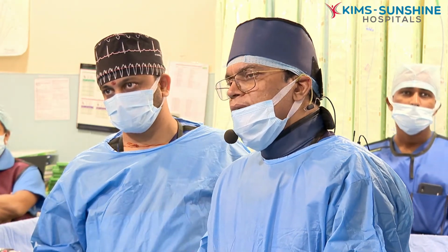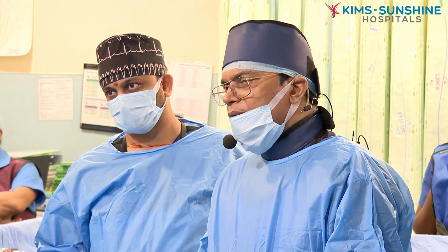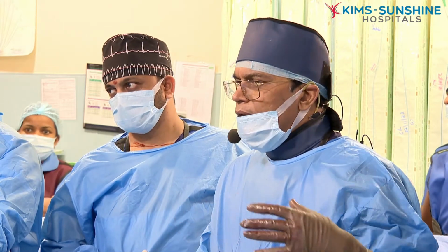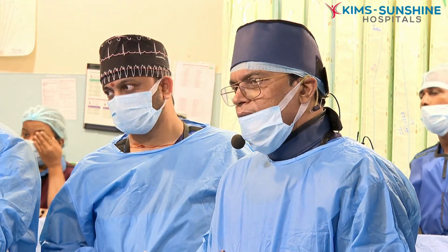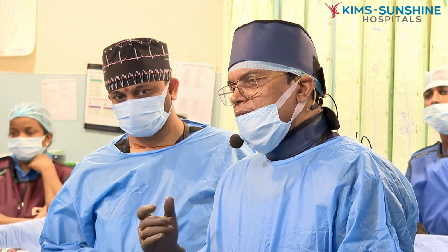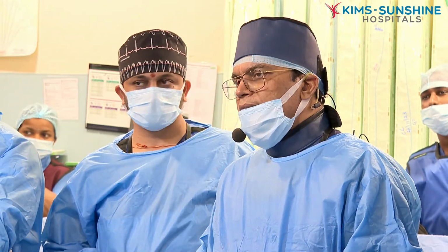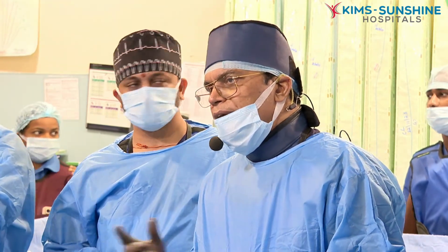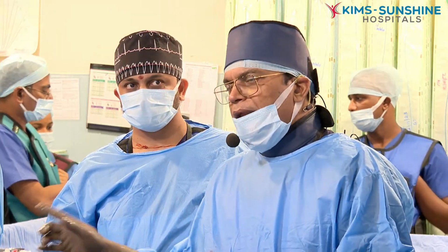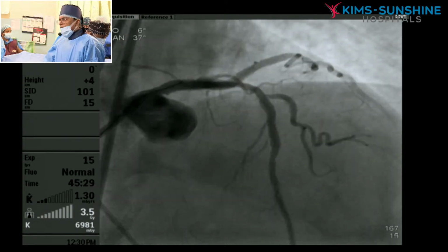But even today ROTA is a wonderful tool, but now the ROTA Pro is definitely much more handy, much simpler to use compared to the earlier system, where you need a lot of hand and foot coordination. That is not required with ROTA Pro. So it is very simple to use, and at the same time even a single operator can use it, using the brake paddle, DynaGlide, everything.